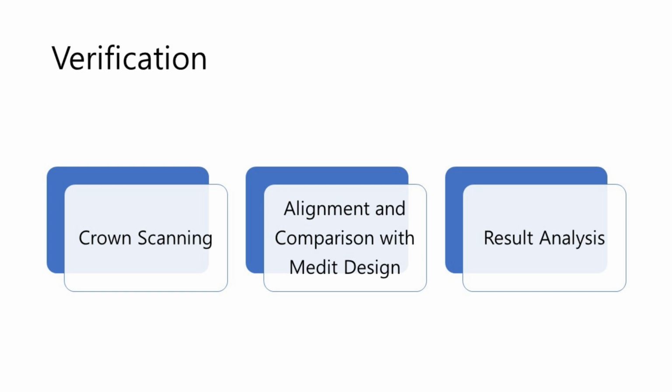While exposure time plays a critical role in successful printing, it's not the sole factor. For the prosthetic to be fully functional and fit correctly, it must be printed to the precise design specifications in terms of volume and size. To validate this, we will proceed as follows.